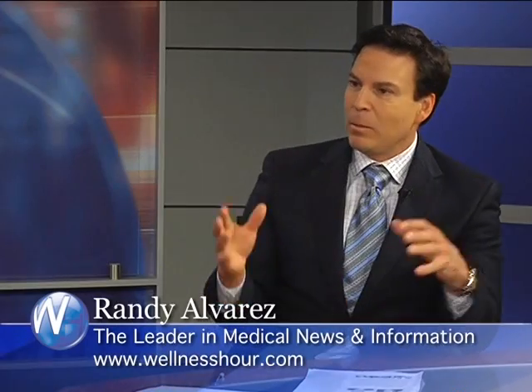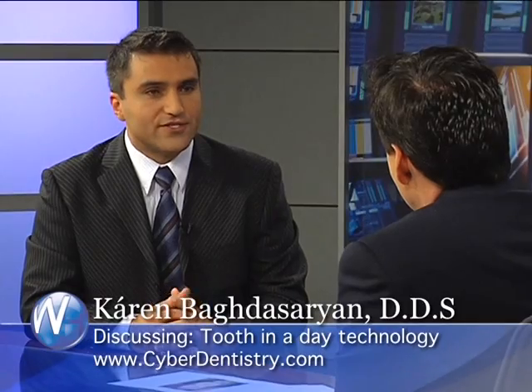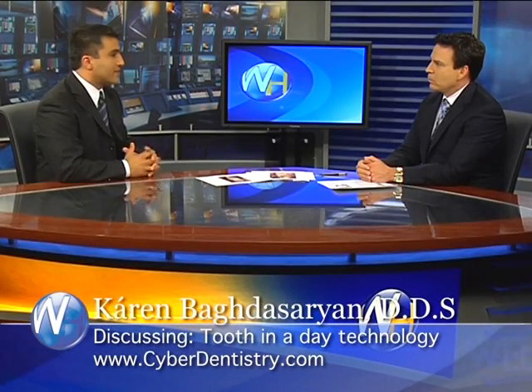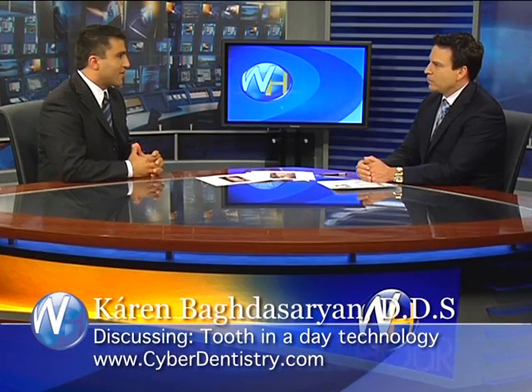Now we're out of time. Final message, though, or other advantages. What have we left out? Advantages for this machine, tooth in a day. My patients really like the fact that they don't get to wear temporaries. When the patients go for a crown, once the tooth is prepped, the doctor makes a temporary crown that is supposed to stay there for a couple of weeks until the permanent restoration is ready.